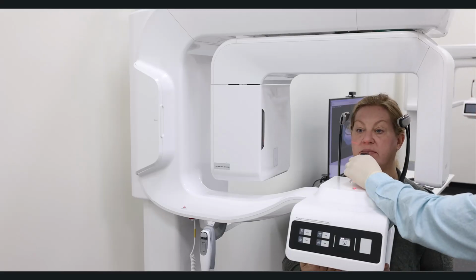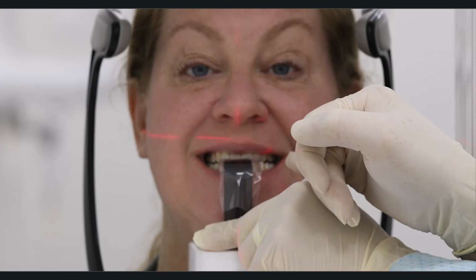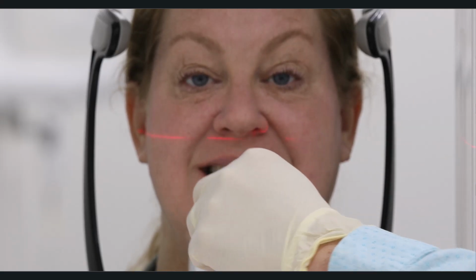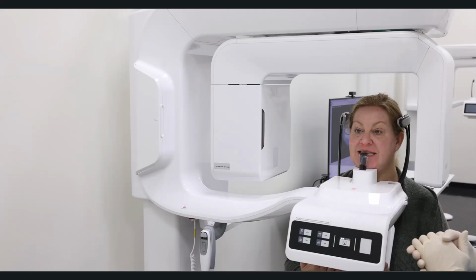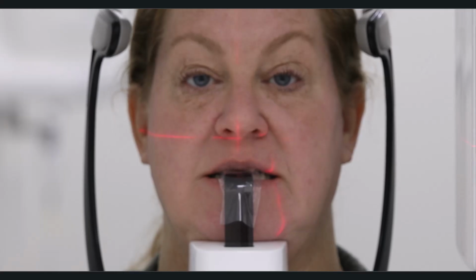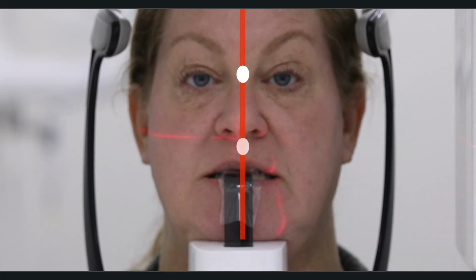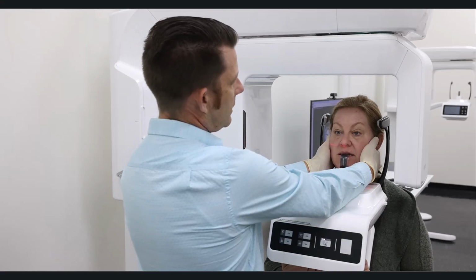And I'm going to go ahead and open and bite and smile really big. I can see the patient is in the bite stick groove, and chin's off the chin rest a little bit. I'm going to gently push down to ensure that chin is firmly on the chin rest. So, 3 steps in positioning for our panoramic. First, I'm going to start with my mid-sagittal beam, ensuring the patient is lined up center, looking at right between the eyes and right through the philtrum. If I do need to move that, I'm going to go ahead and physically move the patient's head to make sure she's lined up center.